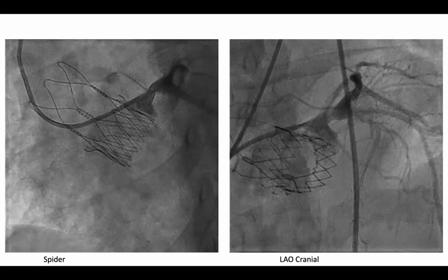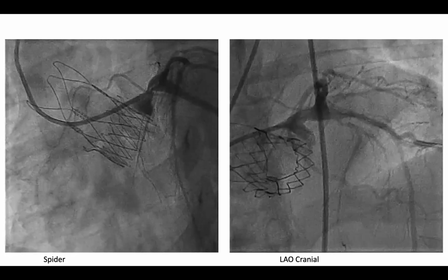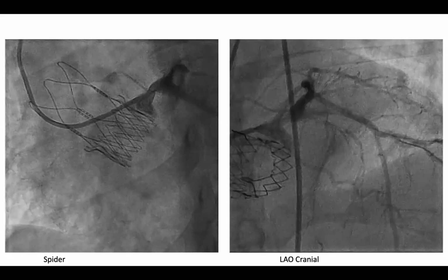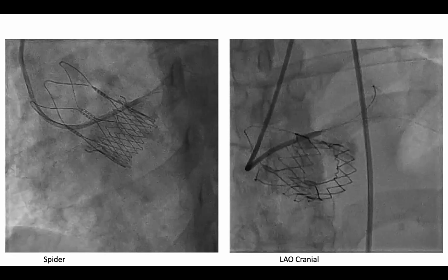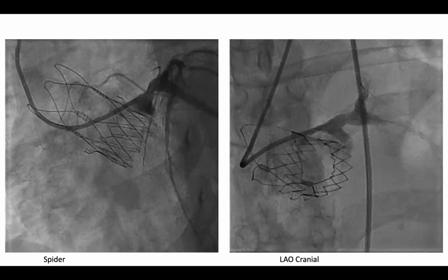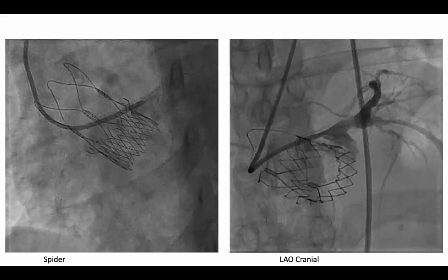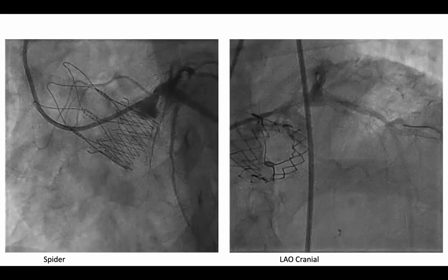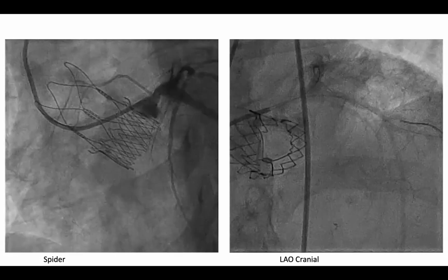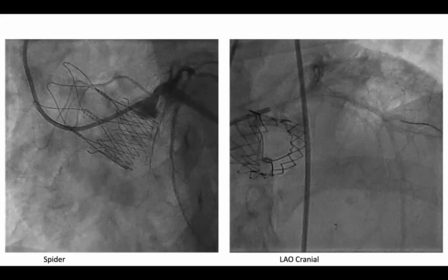Yes. I think that's an interesting and very important comment by Tariq Bhai, because if you're not seeing an obstruction, but the patient has been very unwell and is still unwell, you must be thinking that there was a plaque, and whether that plaque was unstable and had some thrombus on it, which by this time probably is not very evident. So you are looking at possibly an unstable kind of plaque. Yes, there are many possibilities here.